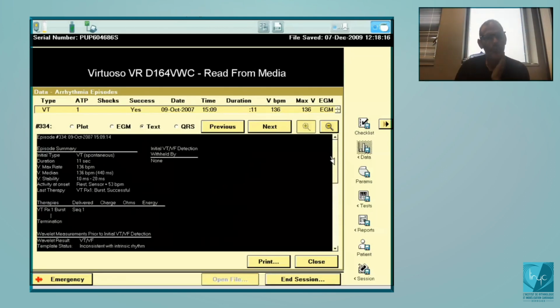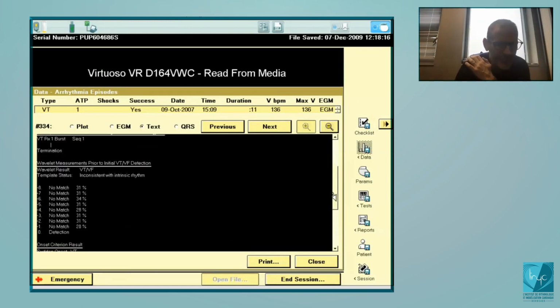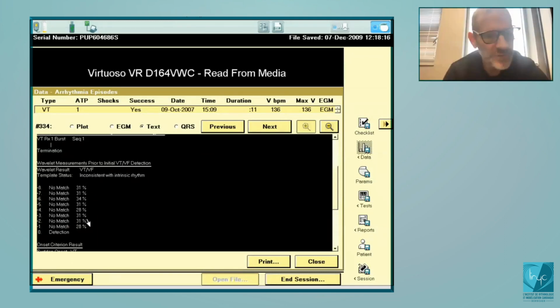And the third one is the morphology. You will analyze the last 8 cycles. You see here the numbers. You see the last 8 cycles before the diagnosis, before your counters are full. And then you will ask if 3 of them are considered similar compared to the reference, then the diagnosis will be SVT. In this example, the threshold programmed for the similarity is 70%.